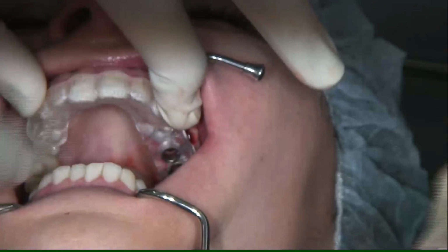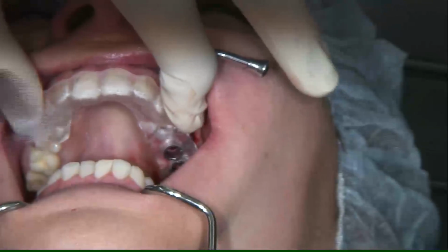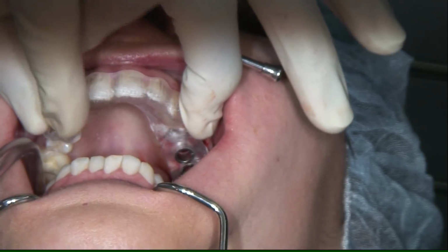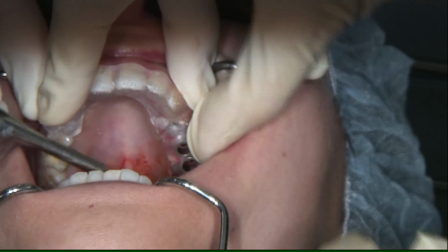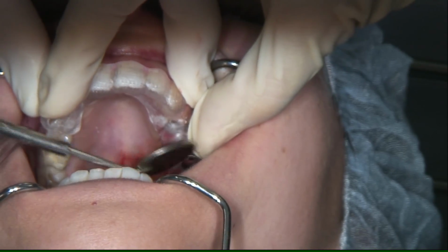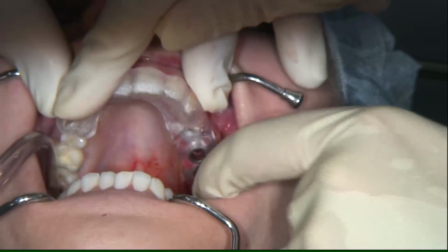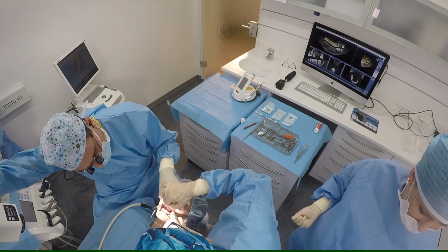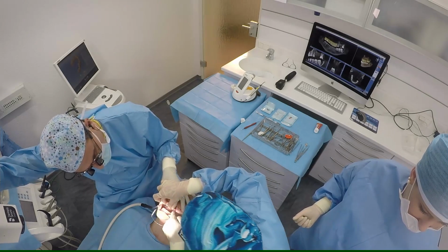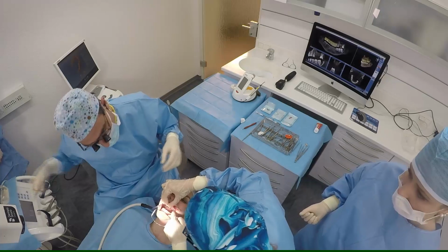These data from the CBCT were matched with the intraoral scan we got from the OmniCam scan before. So a fully digital process. That means also a gain of time, reduced time. We don't need to deliver models by post.